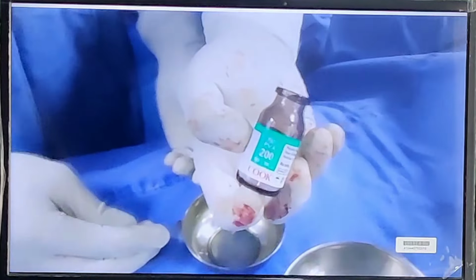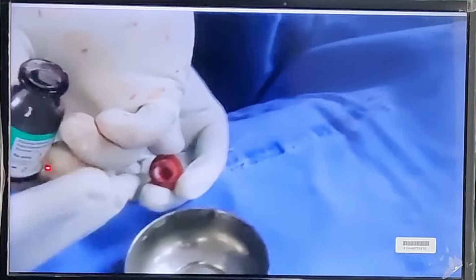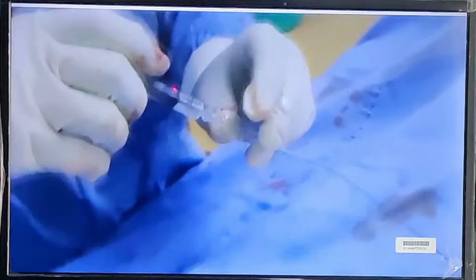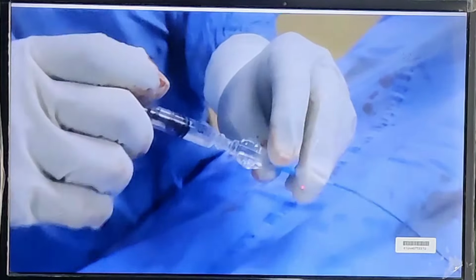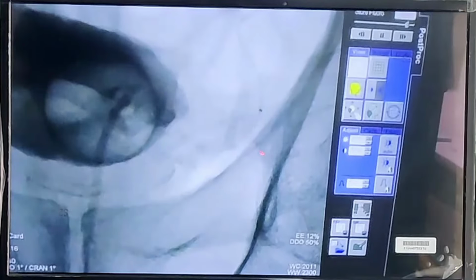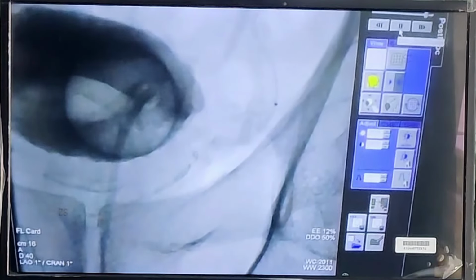Once we are in position, we confirm that we are in the correct position, and this is the prostate gland which is supplied by the prostatic artery. Using the fine particles which you saw in the animated video, that is 200 micron, we are slowly infusing through this syringe. Once we confirm the location of the micro catheter, through this tiny catheter, you can see slowly the dye is going, and this is the prostate gland just below the urinary bladder.